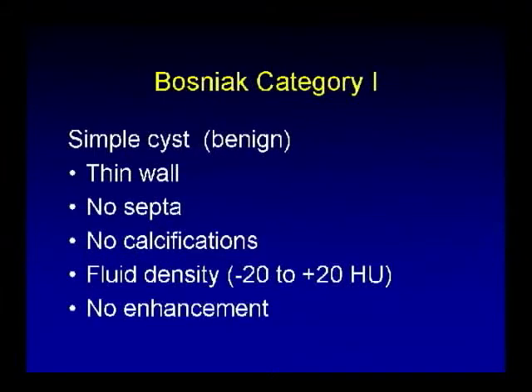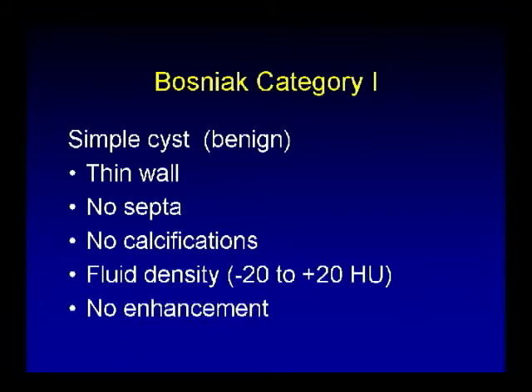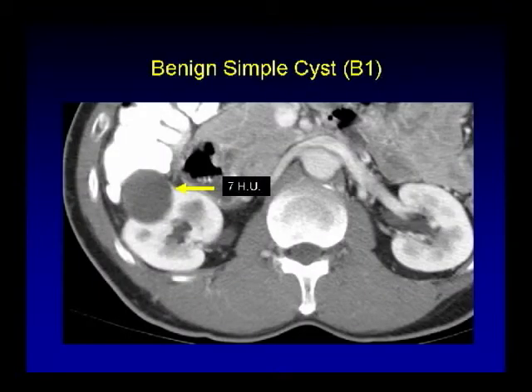Bosniak 1 cysts are simple benign cysts with thin wall, no septa, no calcification, and a fluid density between minus 20 to positive 20 Hounsfield units, and obviously no enhancement. Here's an example of a simple cyst at 7 Hounsfield units, Bosniak type 1 cyst, benign.